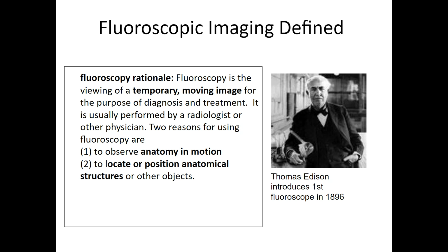What is fluoroscopy? Have you guys seen it at this point? Or maybe you've not been involved, but seen some fluoro. We know that it's kind of like live-action X-ray, right? It's the ability to go beyond just these static images that we usually see and see something dynamic. So we're able to watch barium flow down someone's esophagus into their stomach. We're able to watch blood flow or contrast flow through a vessel if we're in angio.